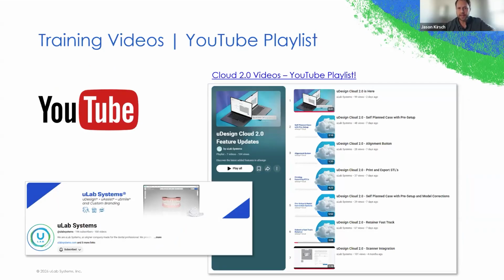A lot of the things I went through today, you can find on YouTube. We have our own channel, it's at uLab Systems on YouTube. If you search for that, we have short videos on a lot of these steps that we went through. We've got the self-plan, how to upload a self-plan case, the alignment button, how to export. So if you forget any of these things, you can always go through the YouTube channel and find those videos, and it'll get you there pretty quick.